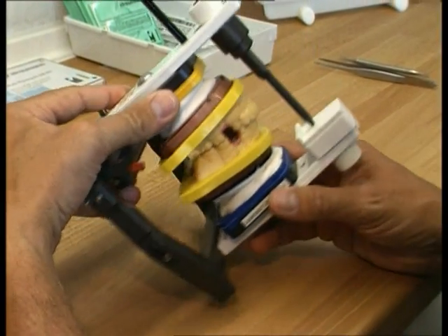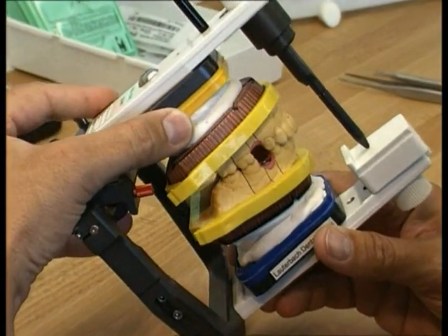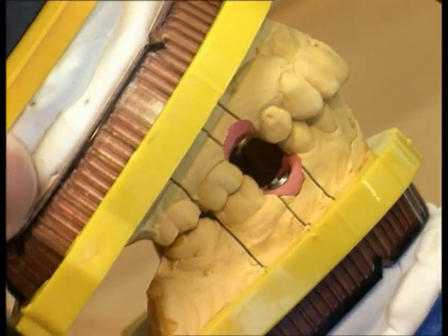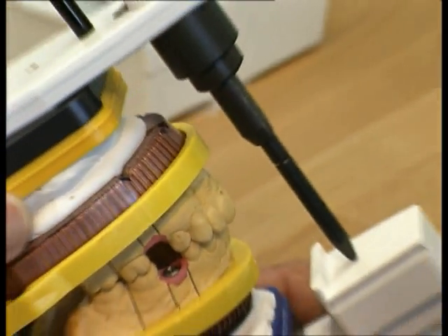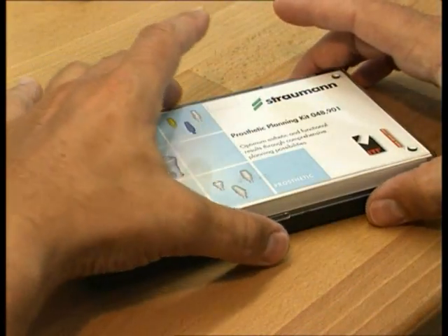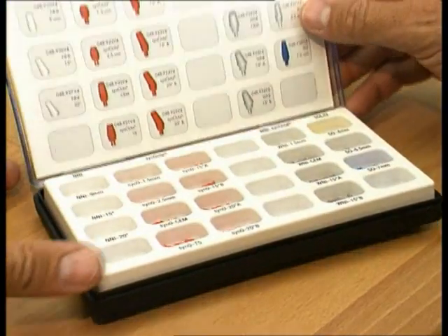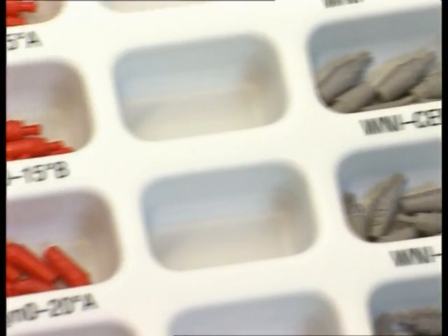These are the completed working models with the 3 implant analogues and the gingival mask. After checking the clinical situation on an articulator, abutments can now be selected. For this purpose, a special prosthetic planning kit is available to dental technicians to facilitate the choice of the correct components and to keep inventory levels at a minimum.